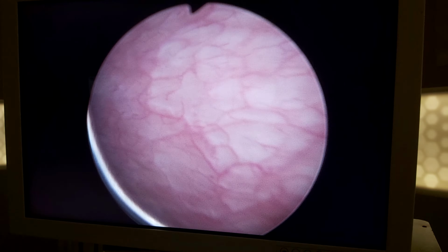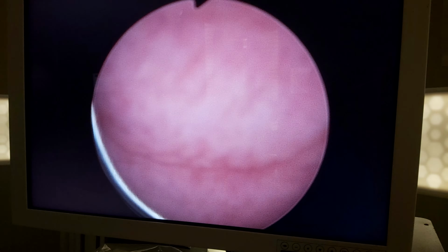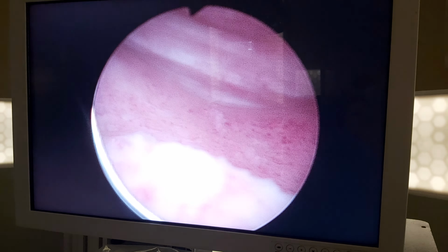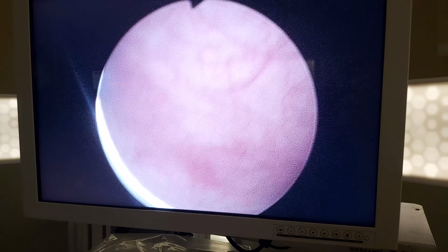When compared to this part, this red part seems more diseased. Now we empty, and look, it comes into contact when the bladder is empty. Now the bladder is empty. I am just filling it a little bit, and this part, the red part, comes into contact with the leukoplakia tissues. That's proof for me that there is some problem, and this problem is affecting this part. When the bladder is empty, these two places are in contact, and also this part comes into contact with this part.